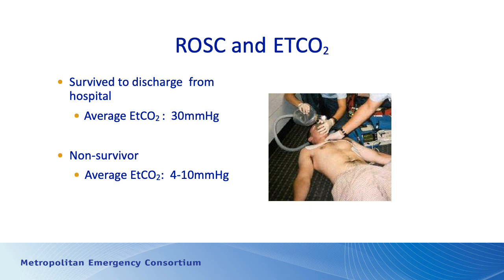So if you look at CO2 values as a measure of prognostication, patients who have higher end-tidal CO2s during the course of their CPR and immediately upon ROSC, their outcomes or survival to discharge is greater than the non-survivors.